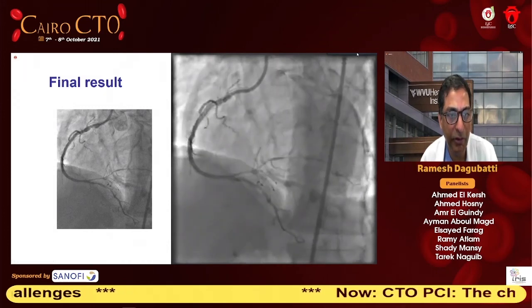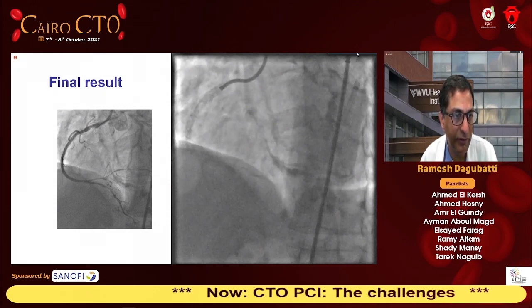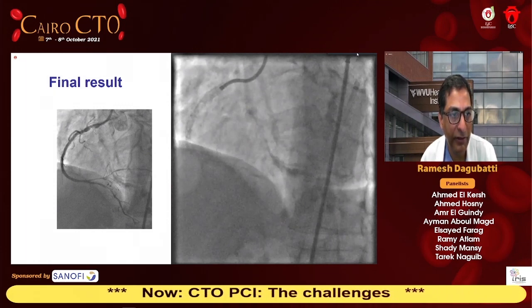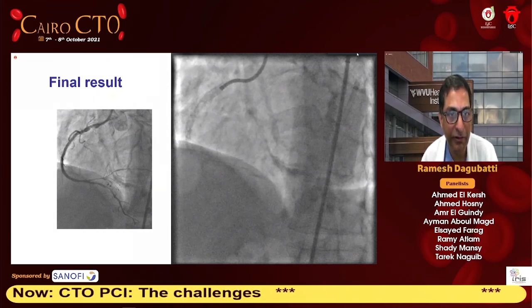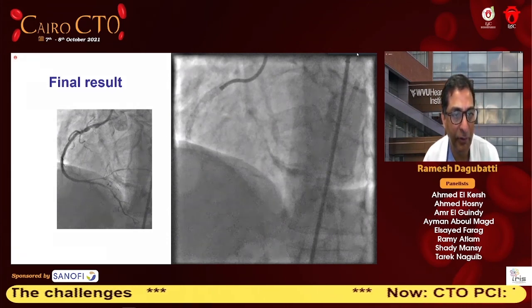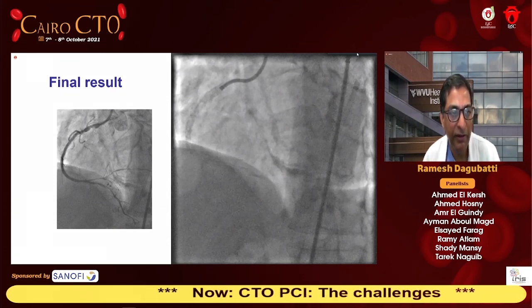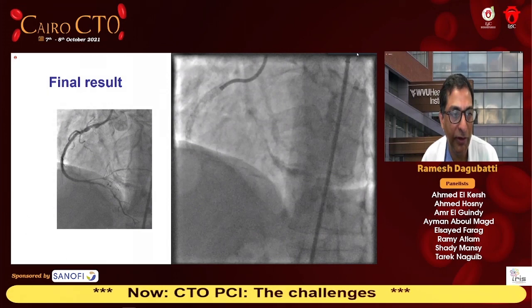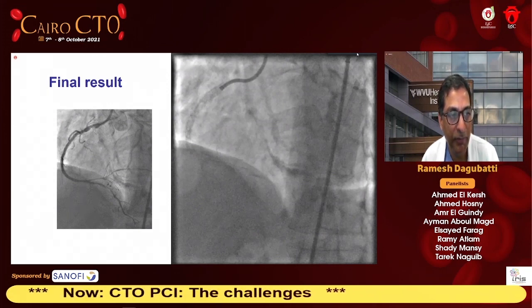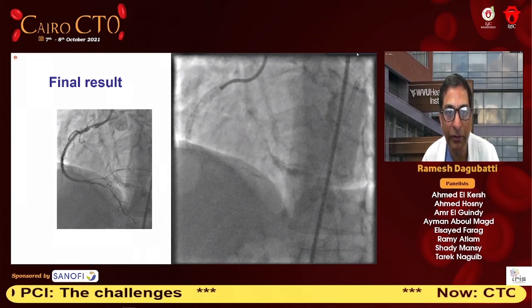One has to be much more knowledgeable about the first line, which is grenadoplasty. The second one is anchoring balloon or anchoring wire with the guide extensions. Third, in my recommendation, would be laser. And if you're not successful with that, the fourth line would be subintimal tracking with the wire and anchoring with the balloon in the subintimal space. With that, you should be able to advance your balloon over the uncrossable lesion wire, which was there in the original true lumen of the CTO.